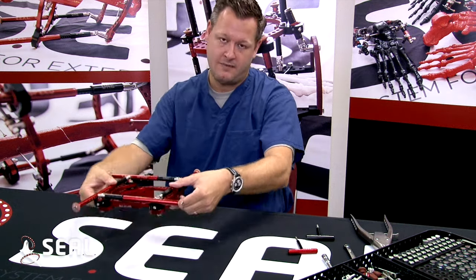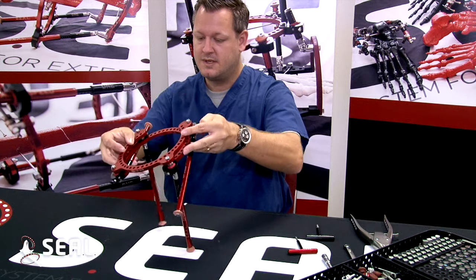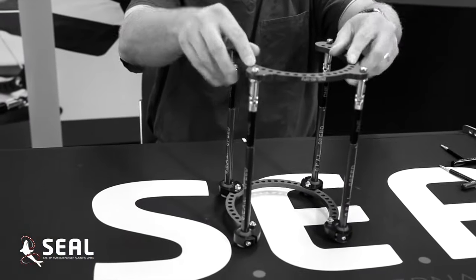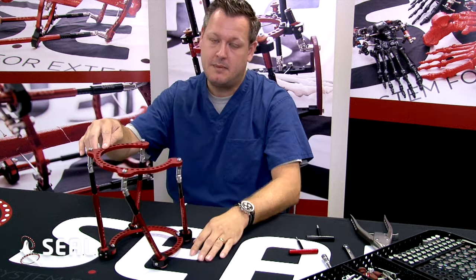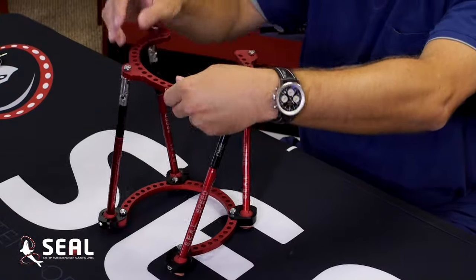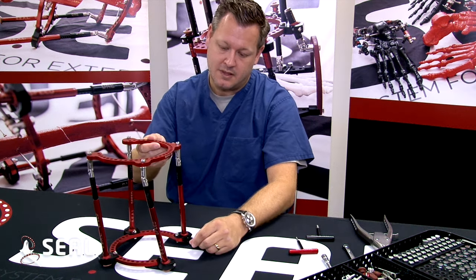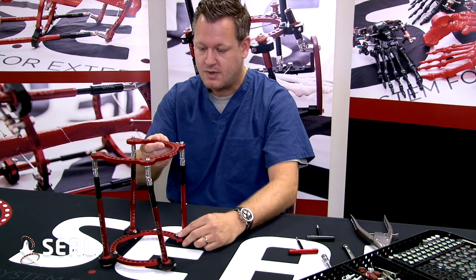As we take the frame out of its package, as you can see, we flip it around, and the frame literally drops down, ready for use. A couple nice elements about this frame — obviously it's pre-packaged and pre-built. You've got 5/8 rings that come with it initially, which can be changed out. You have a multitude of versatility within the instrumentation and structure of the frame.